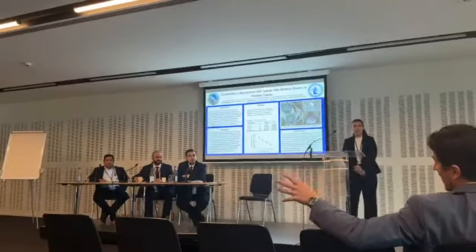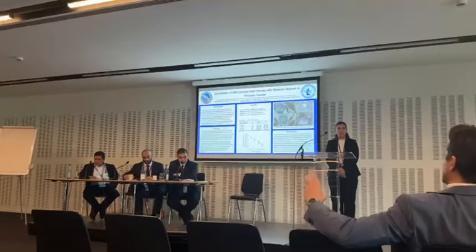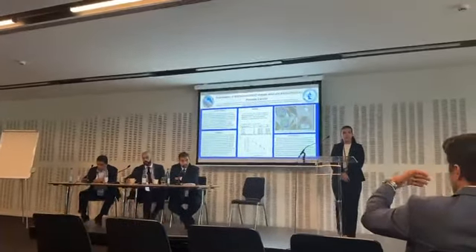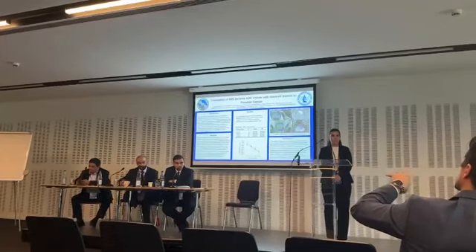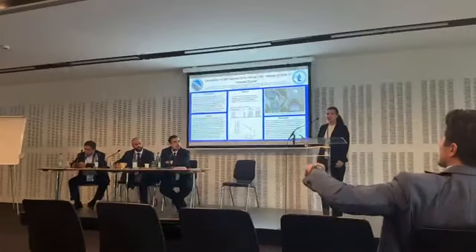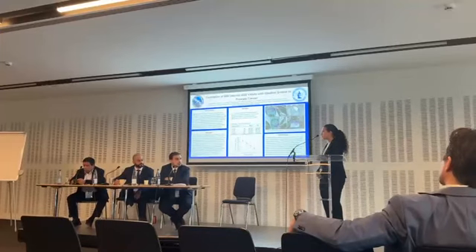Just a question. Like I said, every MRI has calibrations. Everywhere is different. So in a real scenario, if you go forward with this project, the patients will always be in the same institution, correct? I would hope so, yes. So to be able to use these values... what if the patient changes the MRI machine? How can we standardize this?